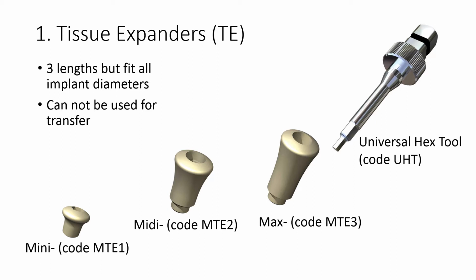However, it's important to realize that these healing abutments are not only guiding the tissue, but they can also be used in protocols to boost the soft tissue and develop the biotype of the soft tissue as well. But these are all clinical techniques, which are discussed in our training programs.